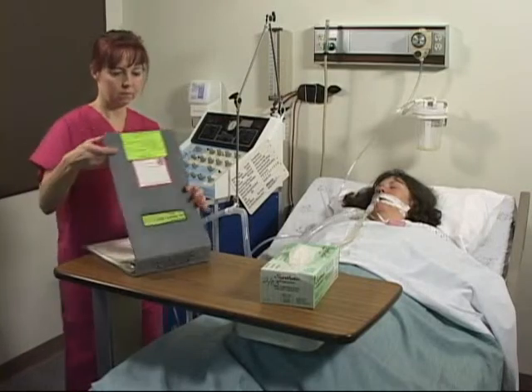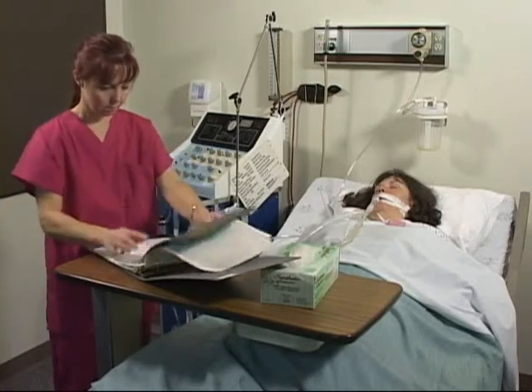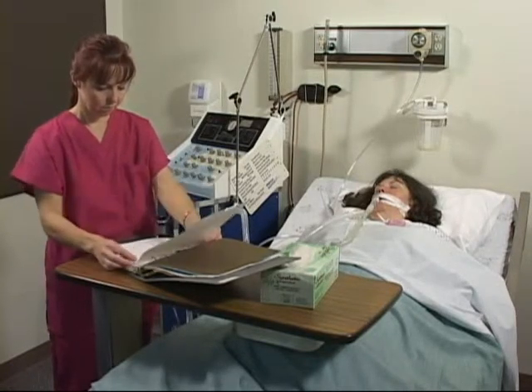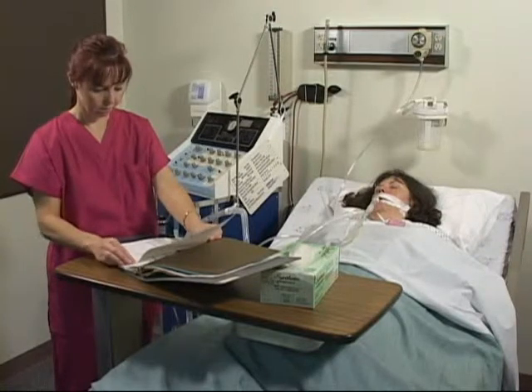Prior to suctioning any client, conduct a baseline assessment for comparison during and after the procedure. Review the client's previous arterial blood gases and oxygen saturation values when available. Evaluate the client's ability to cough and voluntarily deep breathe. This will help the secretions to clear from the lungs as well as increase the tidal volume during the suctioning process.